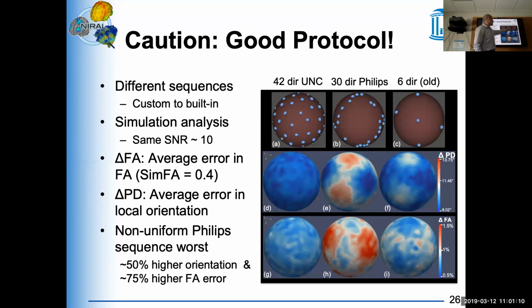And this is a Philips scanner sequence that we observed in a study on Huntington's disease. This is the sequence that comes with the scanner. That was like 15 years ago, but they ran their whole study with this sequence here. And we have to tell them that's a crappy sequence. Why did they choose that? Did they just not think? They didn't know. So these are the visualization tools that you see here.